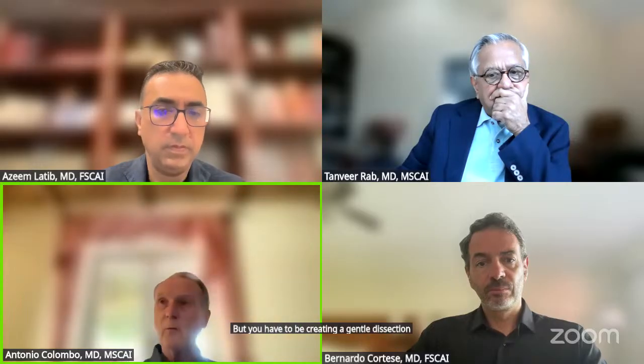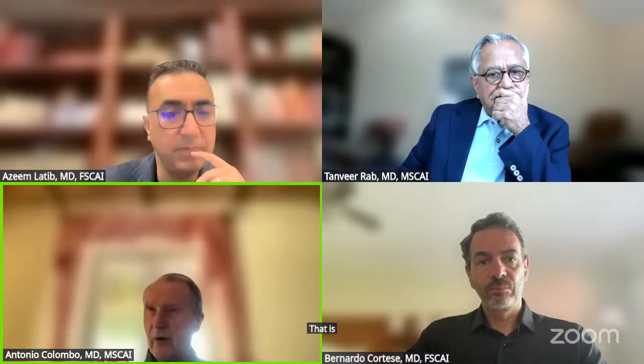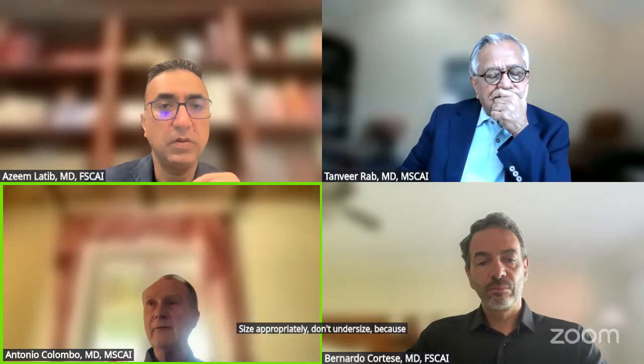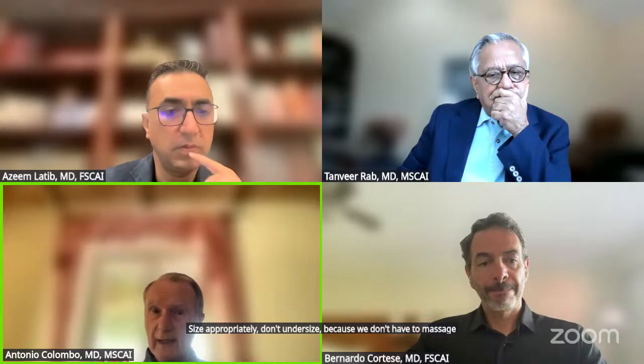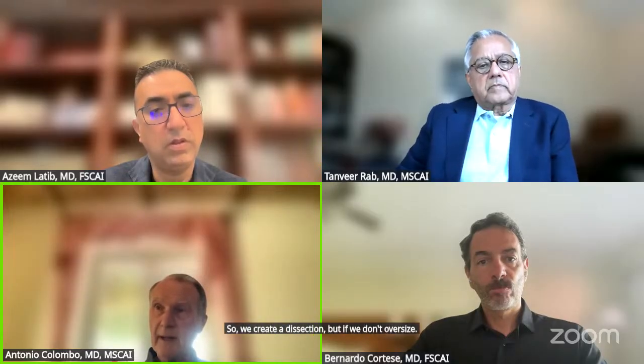I know that the word is easy to say, but it's not easy to perform. But if you don't oversize the balloon too much, size appropriately, don't undersize, because we don't have to massage the vessel, we need to dilate the vessel. So we create a dissection, but if we don't oversize, it's not a bad dissection.